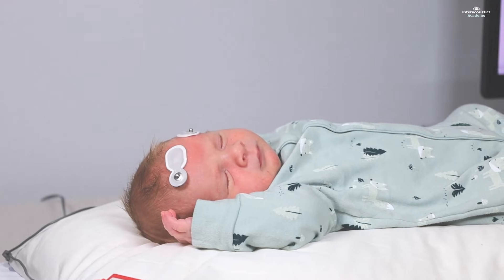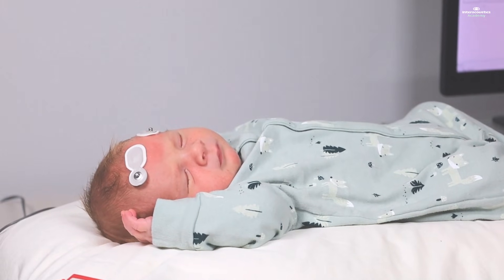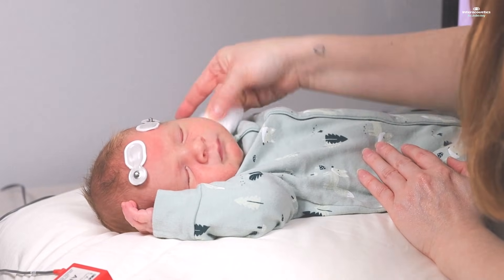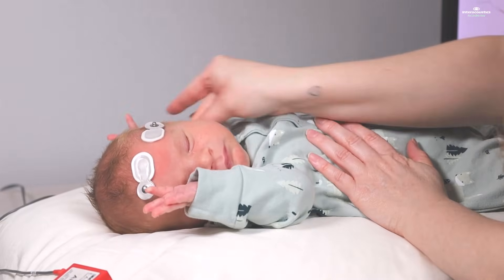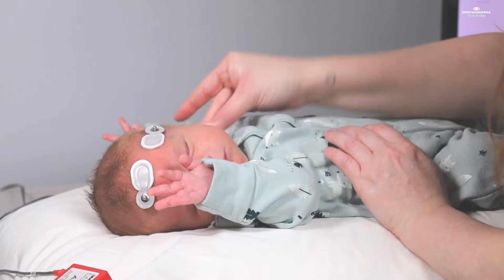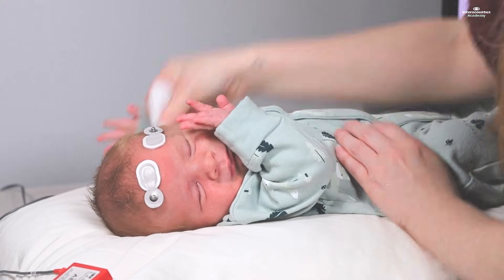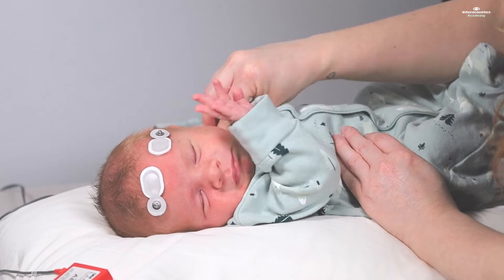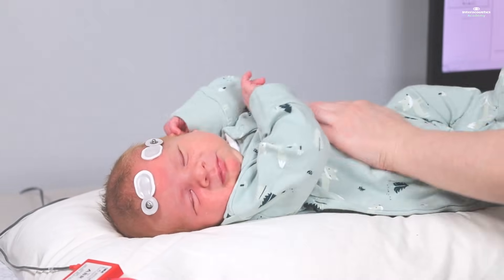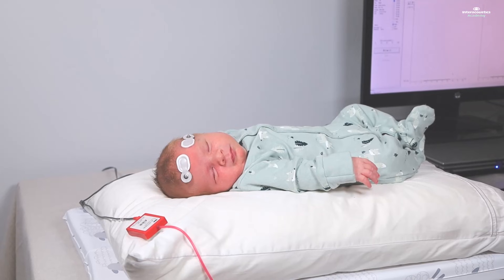Moving on to the left ear next. The baby remains calm and cooperative throughout the process of placing the insert earphone.